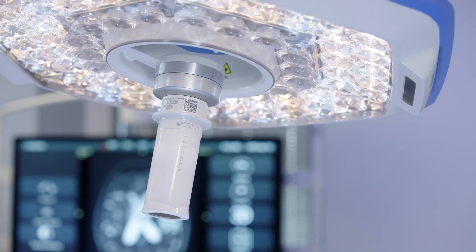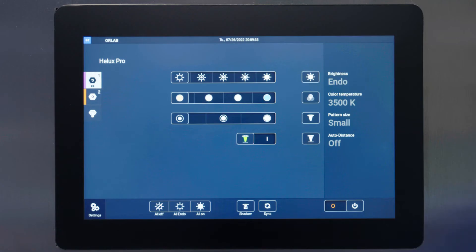The Helix Pro Surgical Light includes three spot size settings ranging from 6.3 inches to 9.8 inches or 16 to 25 centimeters. These can be adjusted at the wall control based on surgical procedure or surgeon preference.